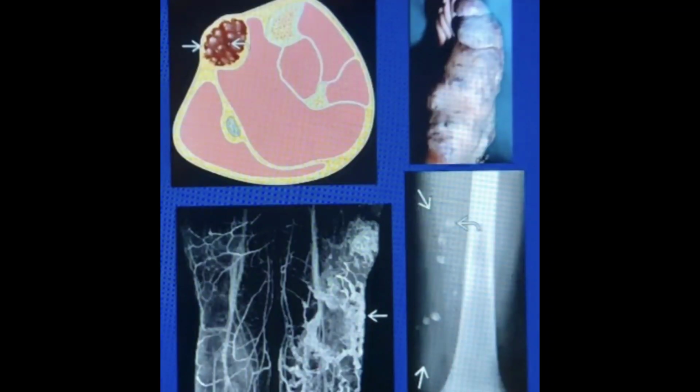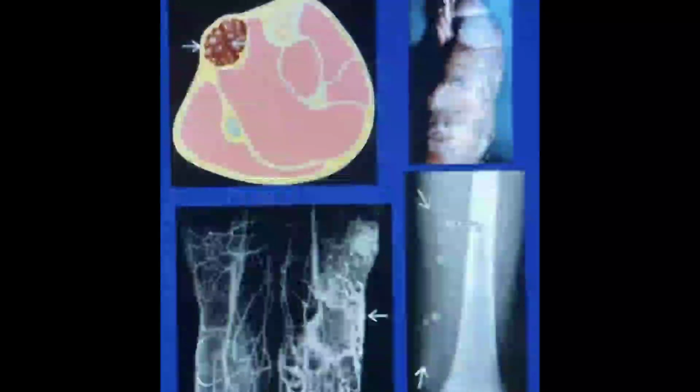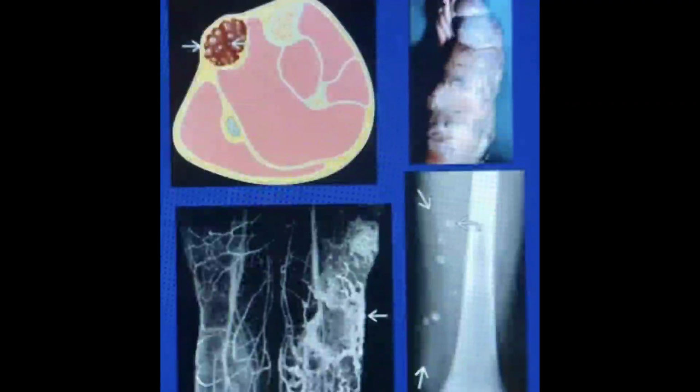Hemangioma and vascular malformations occur in the soft tissue and sometimes within the bone, and it is termed a benign lesion closely resembling normal blood vessels. However, the hemangioma may be classified depending on the prominent vessel types involved.